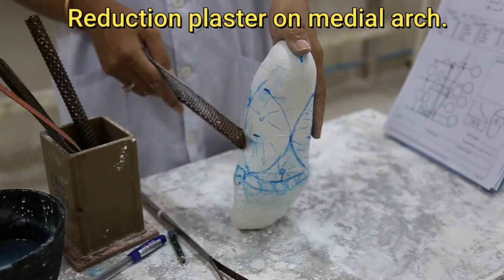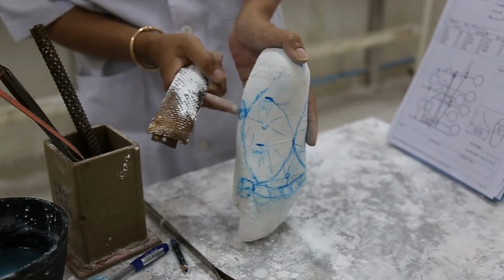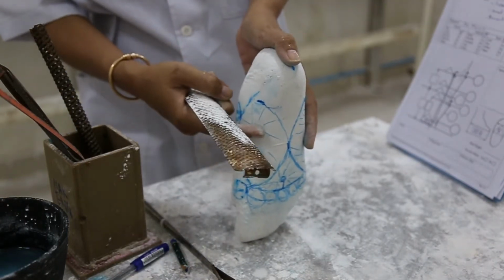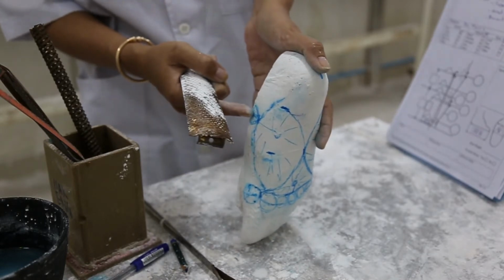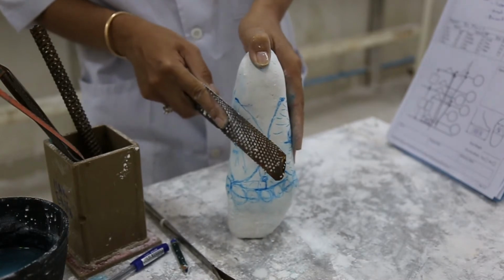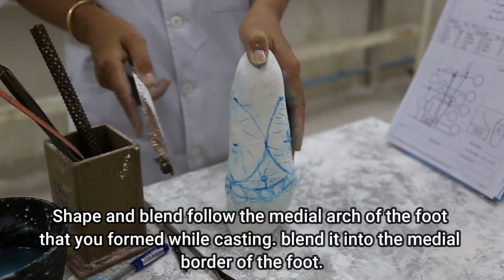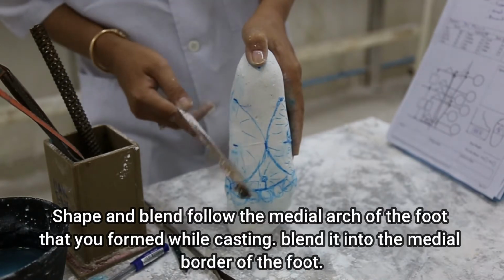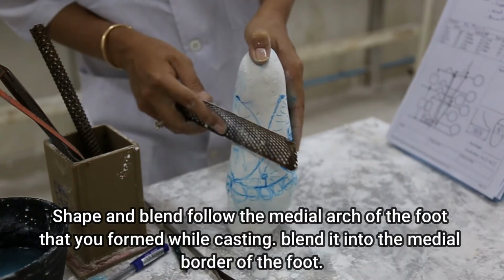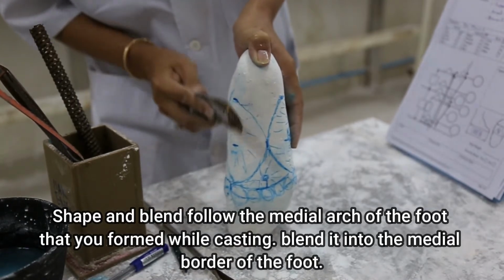So next step, I'm going to do the reduction. Firstly, I'm going to reduct on the medial arch. As I said, the deepest point for the medial arch must be at the level of the navicula. Just blend deeply, about 3 to 5 millimeters, and then later on you are able to blend it.